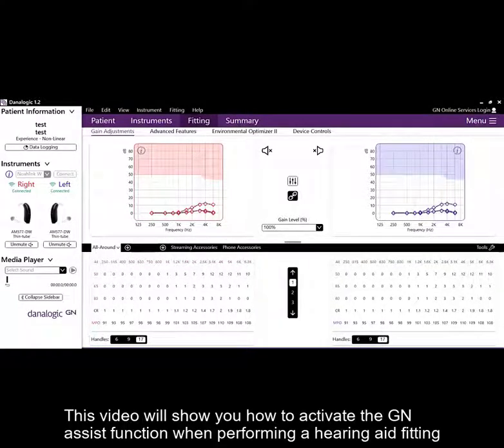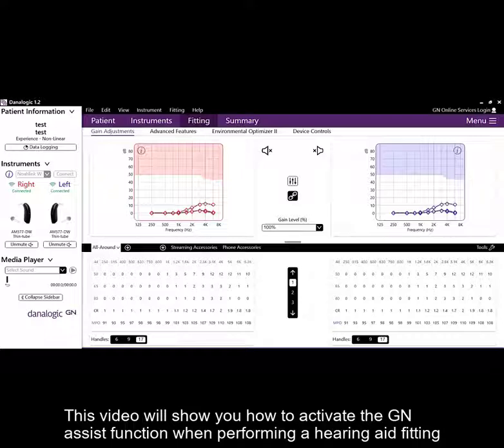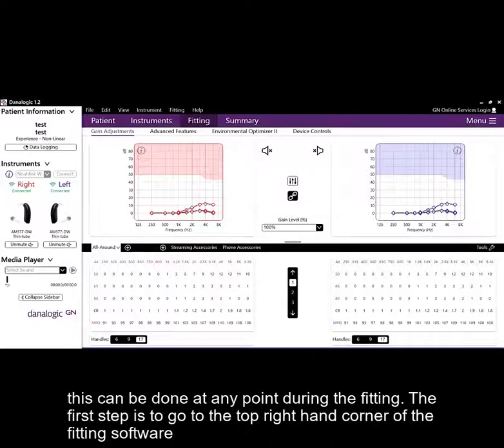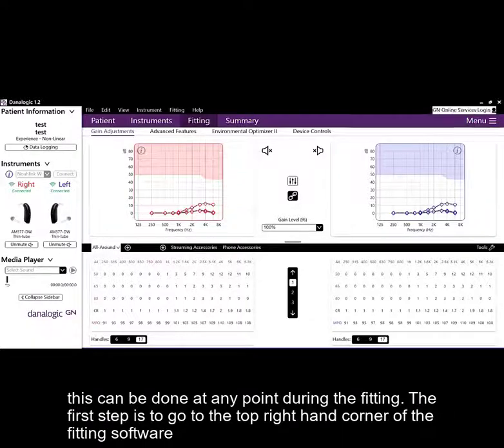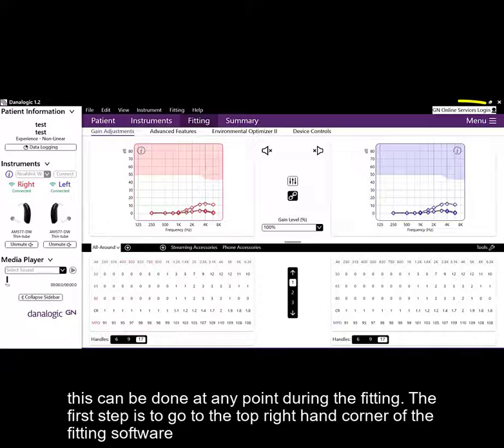This video will show you how to activate the GN Assist function when performing a hearing aid fitting. This can be done at any point during the fitting. The first step is to go to the top right hand corner of the fitting software.